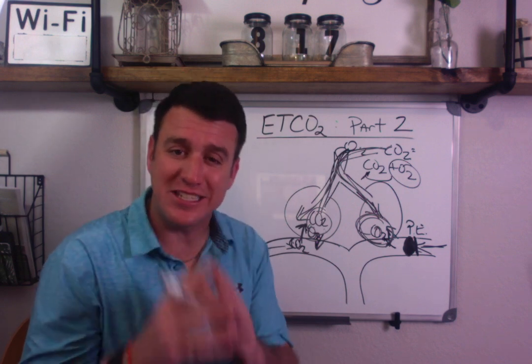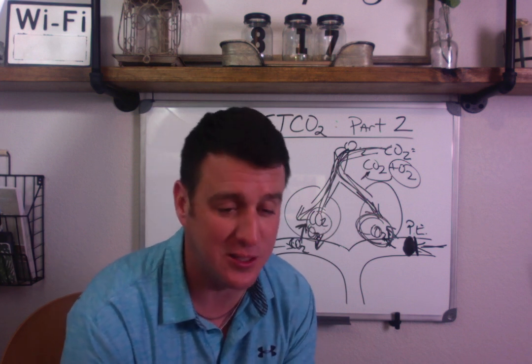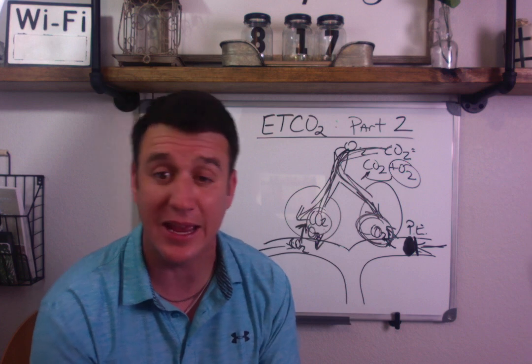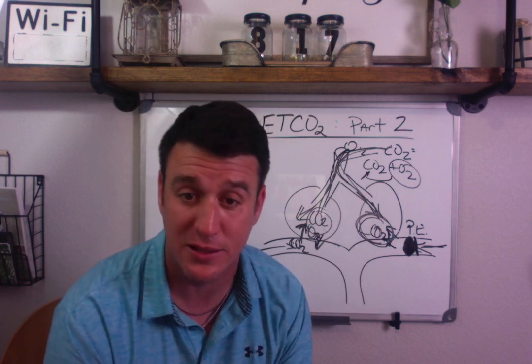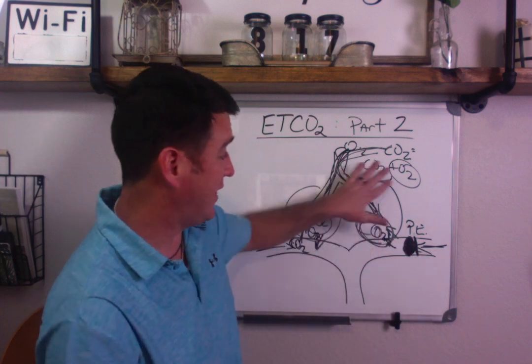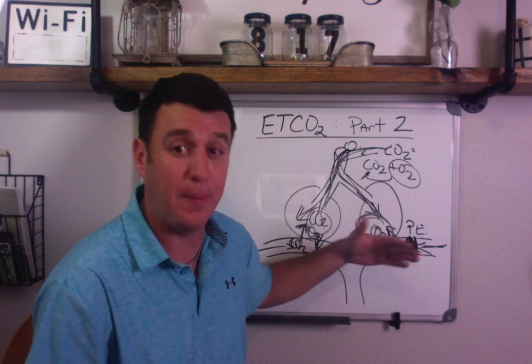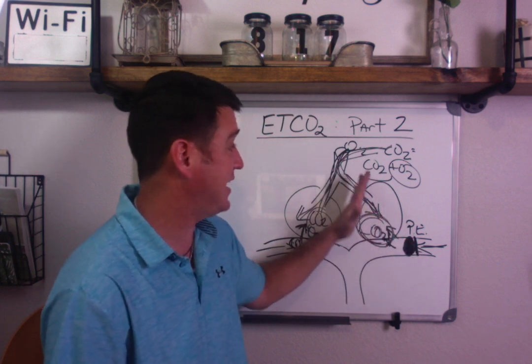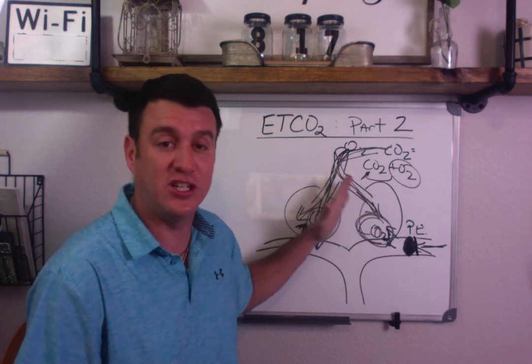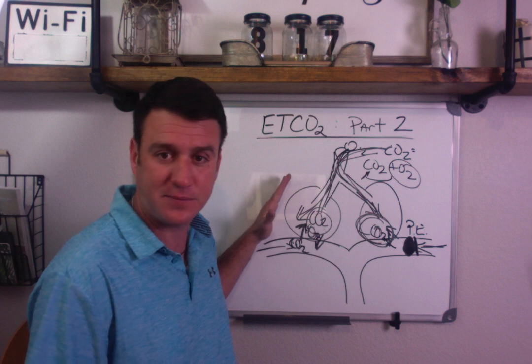And so this is what I want you to understand. Why does a dead space problem, a pulmonary embolism, cause an increase in your gradient? And the answer to that is simply this. The exhaled oxygen from the alveoli that is not participating in gas exchange because there is no blood flow, upon exhalation, that oxygen is exhaled and it dilutes the concentration of CO2 being exhaled from the healthy side.